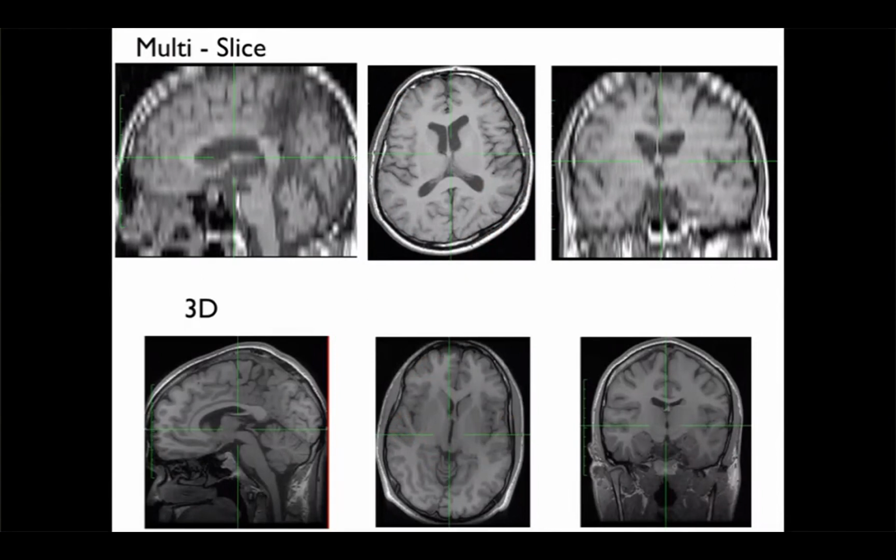So this acquisition was done in 3D, so 3D Fourier, and the difference you can see, of course, is that when you do multi-slice, the slice thickness is usually 2 millimeters, 3 millimeters, and it may have gaps. So if I try to reformat, then it doesn't look great, and you definitely see the gaps. You see here, that can be a problem. So this is kind of not usable. So you only use them in the plane that you acquire.